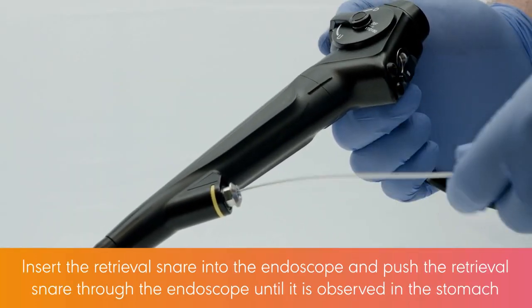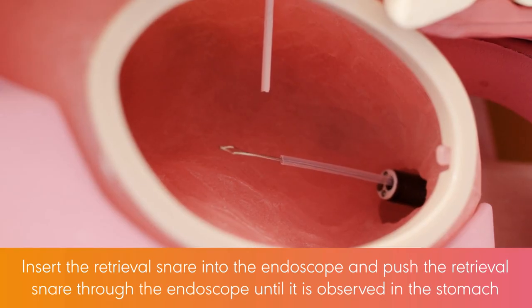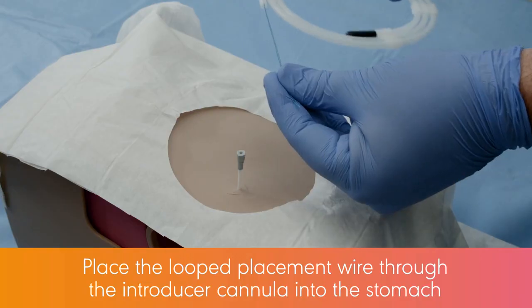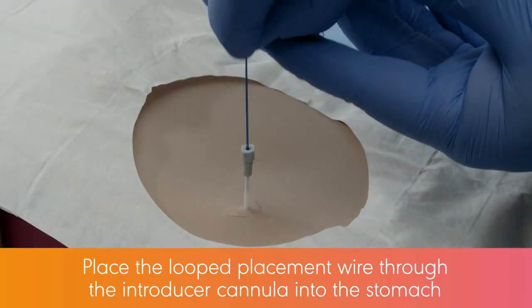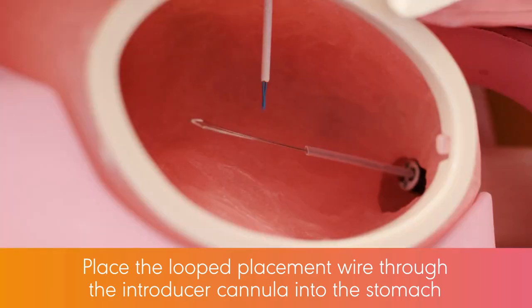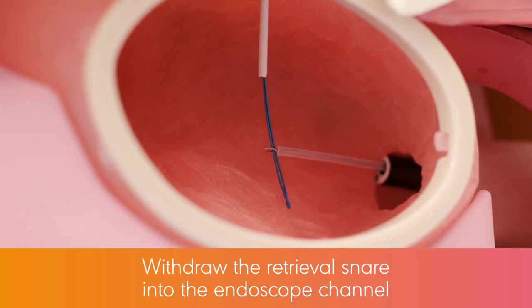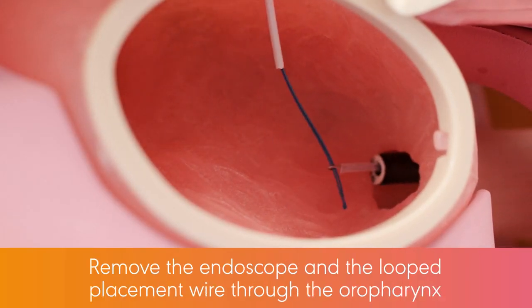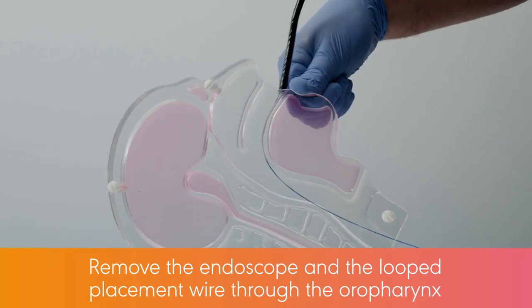Insert the retrieval snare into the endoscope and push the retrieval snare through the endoscope until it is observed in the stomach. Place the looped placement wire through the introducer cannula into the stomach. Grasp the looped placement wire with the retrieval snare. Withdraw the retrieval snare into the endoscope channel. Remove the endoscope and the looped placement wire through the oropharynx.